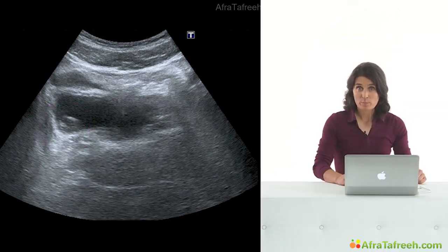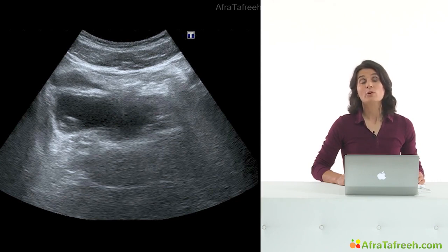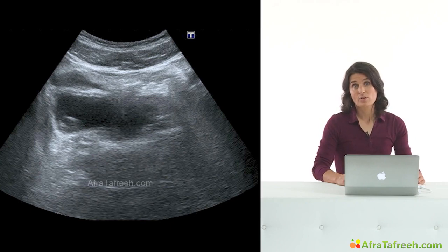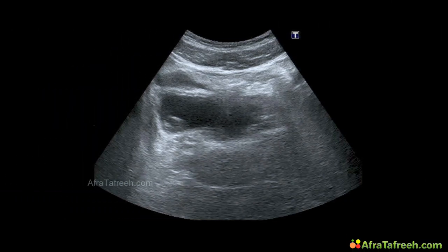And when we turned the patient to his side, the structure stayed at the same place. So it means it was attached to the wall and most probably a urinary bladder tumor. And so we sent the patient to the urologist where there was further investigation and they found, in this case, a malignant tumor, but in an early stage because we already detected it in our ultrasound examination.